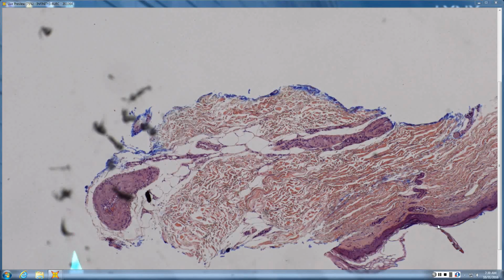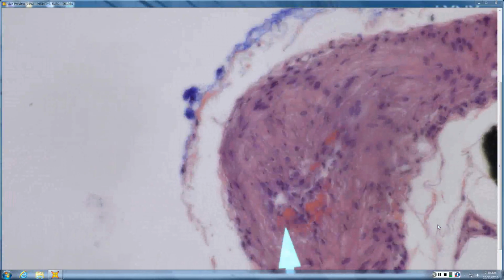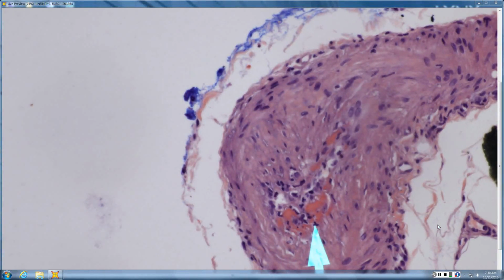In this case, we have hypertrophy of a vessel, abnormality of a vessel. Don't really see inflammation of a vessel, but there's something funky with that artery. I see just a few neutrophils here on higher power. So when you have a thrombus, some neutrophils in that large arterial vessel, what's your differential? Wegener's. Yeah, so Big Five, I guess. It absolutely could be anything in the Big Five. This patient turned out to have polyarteritis nodosa.